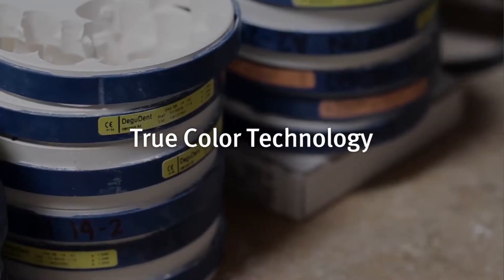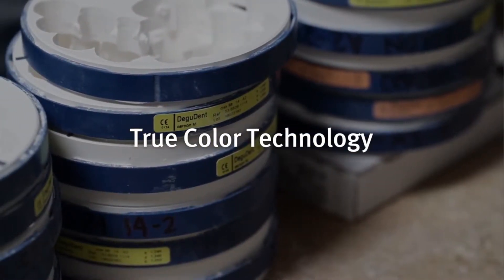The laboratory that we have here is only five people. We're doing about anywhere from 50 to 60 units a day.